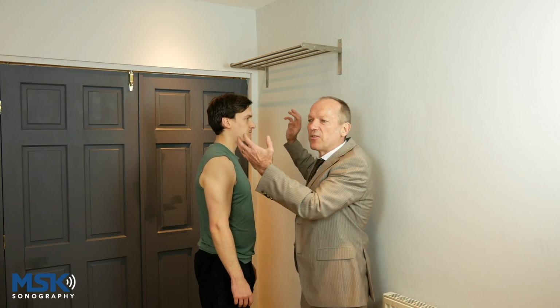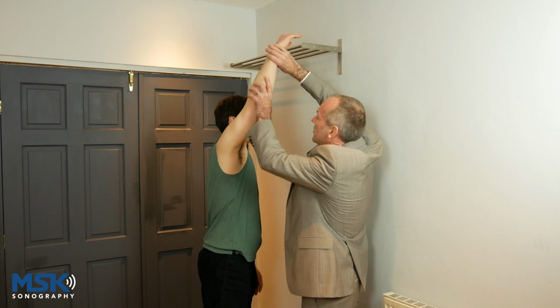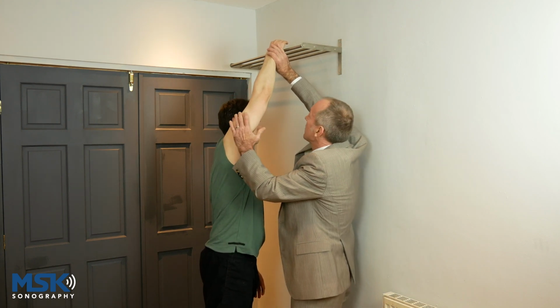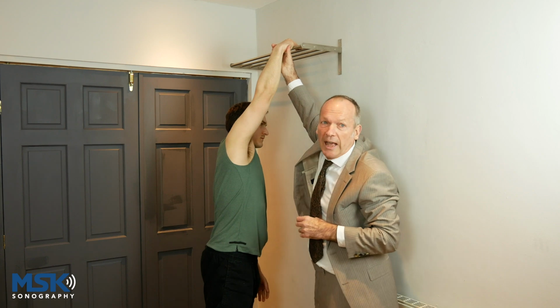With our human model here representing the tendon structure of the rectus femoris, at the top end here, the proximal attachment or the origin, there are two heads. With this arm representing the direct head, and you'll see as the direct head courses from distally to proximally, it passes deeper and medially and sits on the AIIS like a hat on a head.